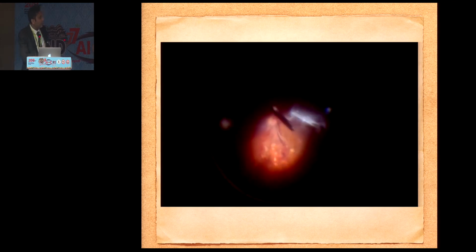Combined detachments are tough cases. Of course, you have to release the traction. The chandelier light and bimanual surgery are the preferred methods. And you have to remove all the traction around the nasal hole, like in this case. This had a massive submacular hemorrhage also.